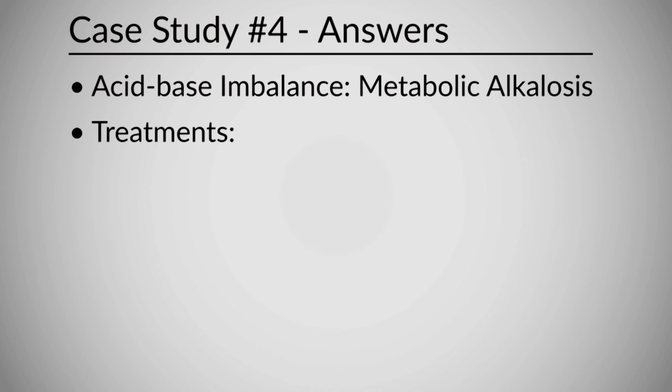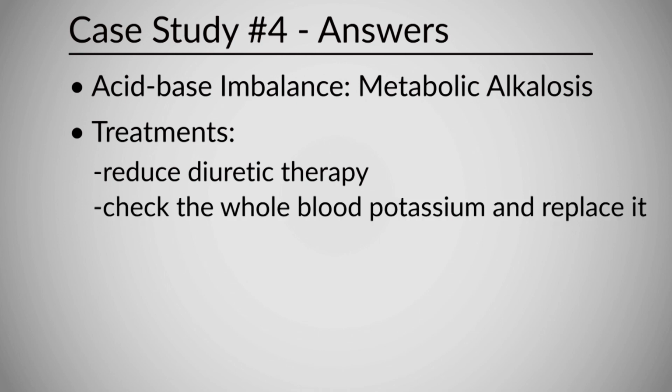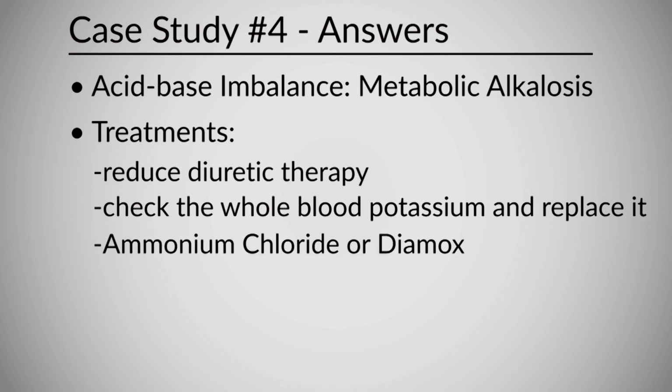The possible treatments would be 1. Consider reducing diuretic therapy. 2. Consider checking the whole blood potassium and replace it if it is low. 3. Consider ammonium chloride or Diamox.